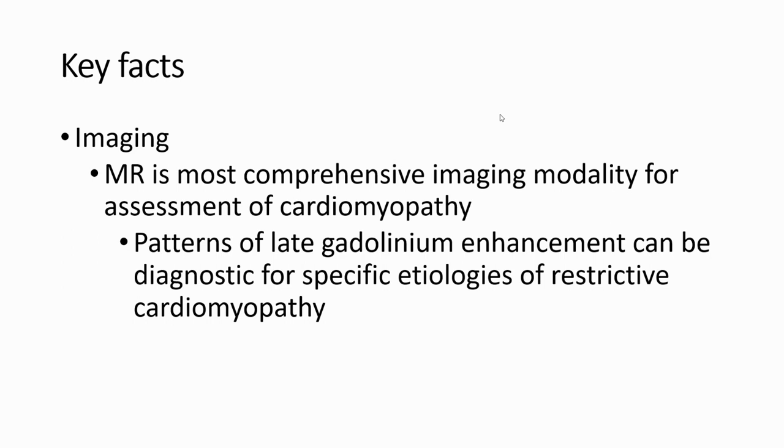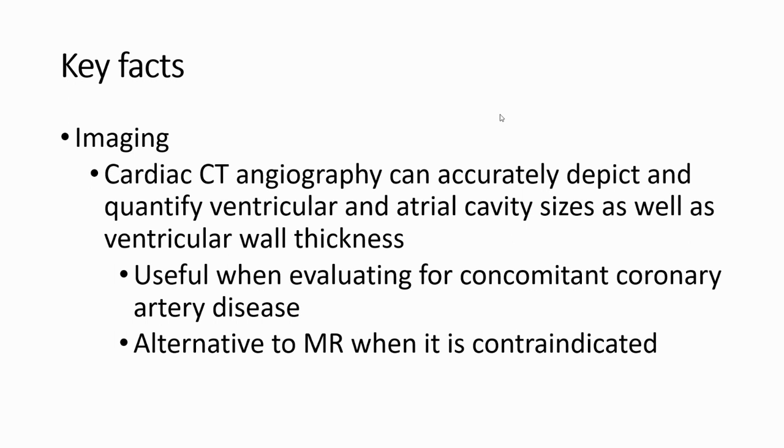The pattern of late gadolinium enhancement can be diagnostic for specific etiology of restrictive cardiomyopathy. And CT can accurately depict and quantify ventricular and atrial cavity size as well as ventricular wall thickness, useful when evaluating for concomitant coronary artery disease. It is an alternative to MRI when it is contraindicated.